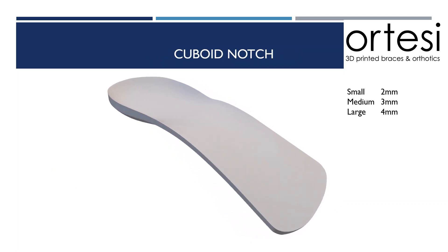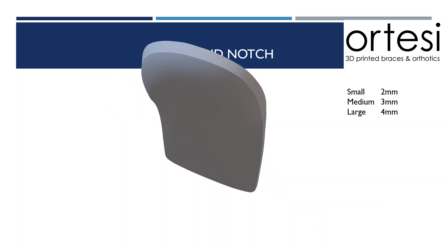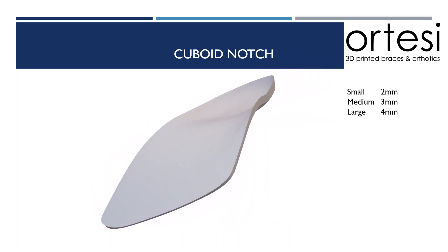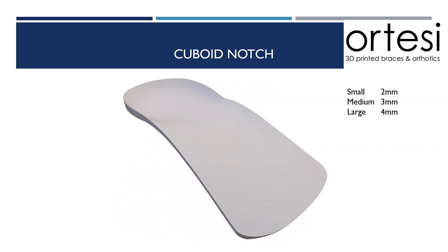A cuboid notch sits further back than a fifth ray plantar grind, underneath the cuboid. This helps to support the keystone in the lateral arch. It's also a really useful modification when prescribing a low bulk orthotic such as a wedge or a concave wedge. With both of these devices, the lateral heel cup and lateral side of the orthotic is removed or reduced significantly to reduce bulk. However, a cuboid notch can be a useful modification to increase that lateral support, to stop the patient from sliding off the device, and to improve overall comfort.